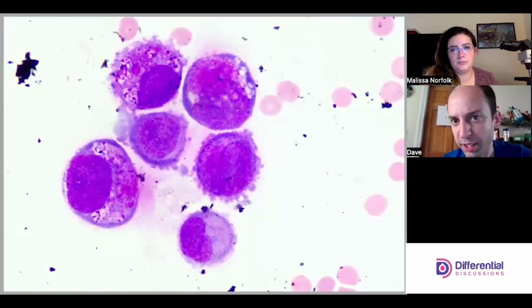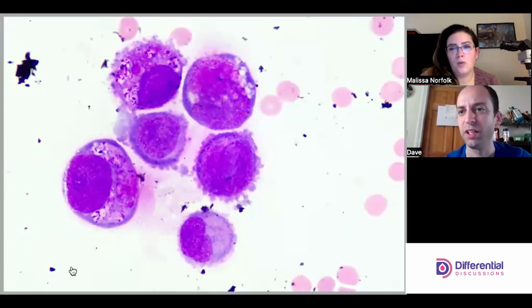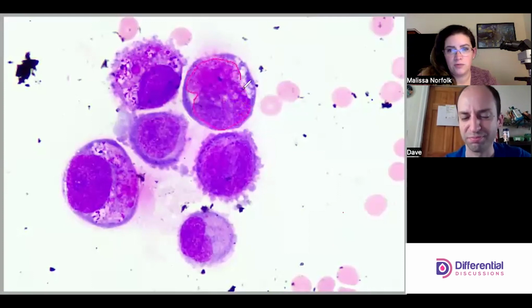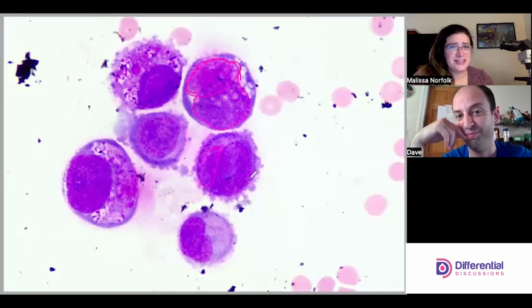And the other thing that's bugging me is these spots in the nucleus where we get that variable staining. Some places here, it's tough to spot where the nucleus even ends. Does this spot a blue randomly in the nucleus? Well, I think the other part that's challenging is when you look at this, you outlined the entire nucleus to look something like this, right? Originally. But when you look at this part right here, same thing with this cell, is that granulation? Is that the nucleus?